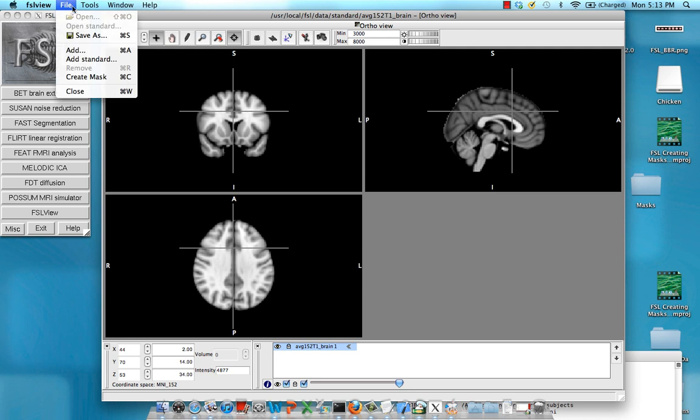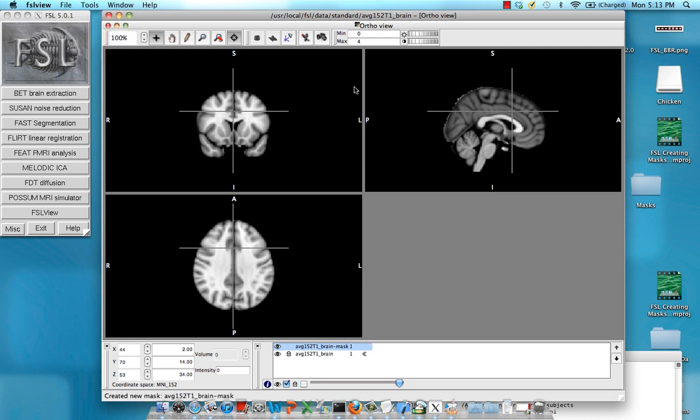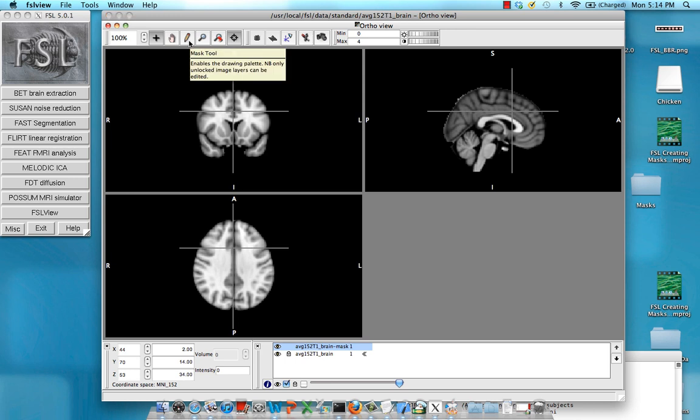To do this, go to File and Create Mask, or Command C, and you'll see this mask tool gets unlocked.